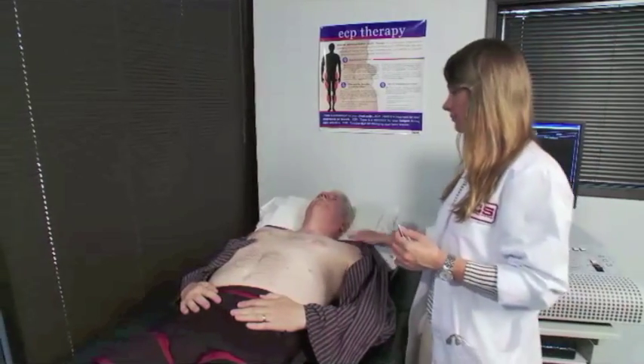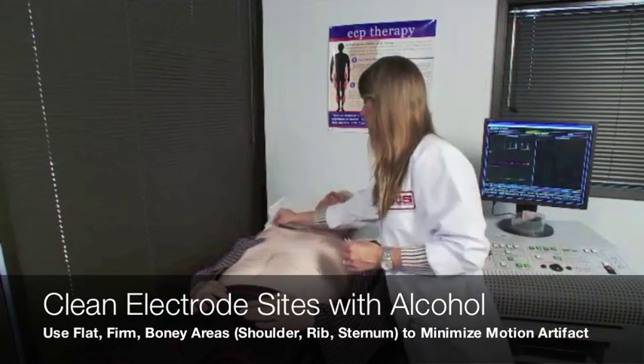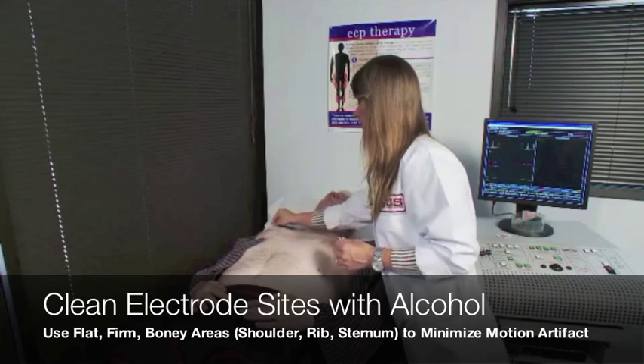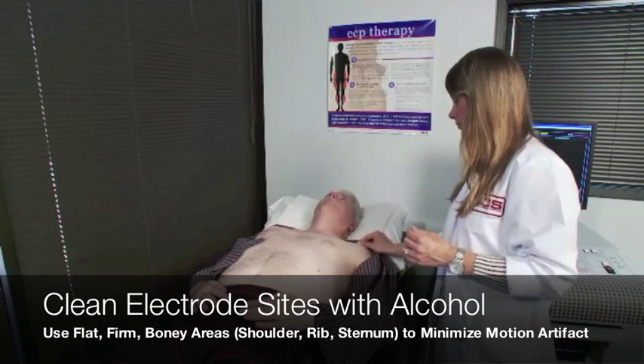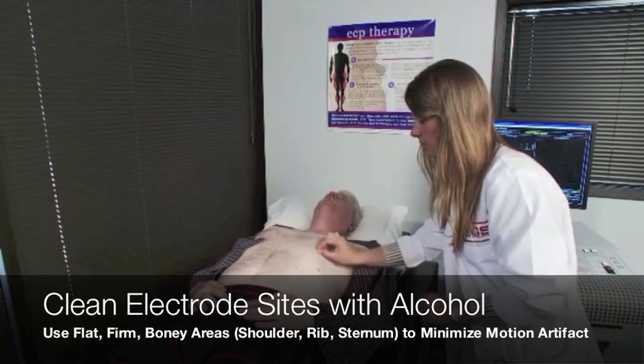First, identify the electrode sites you will use. Flat, firm, bony prominences such as shoulders, ribs, or sternum work best. Clean each electrode site thoroughly with an alcohol prep pad.